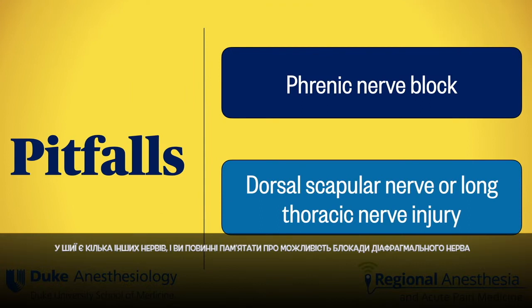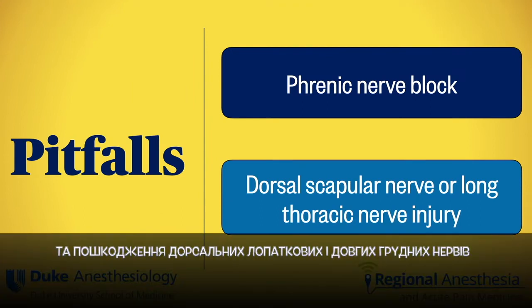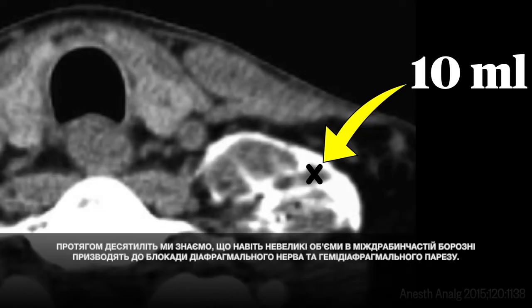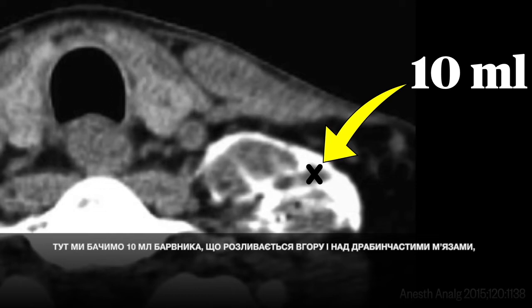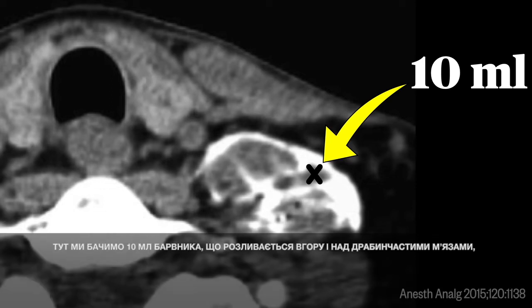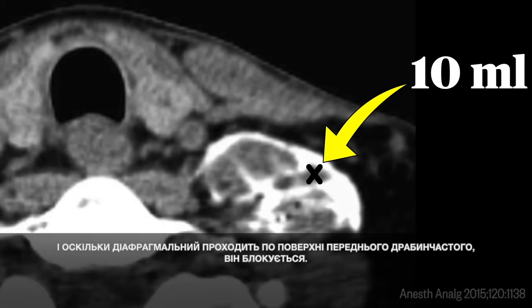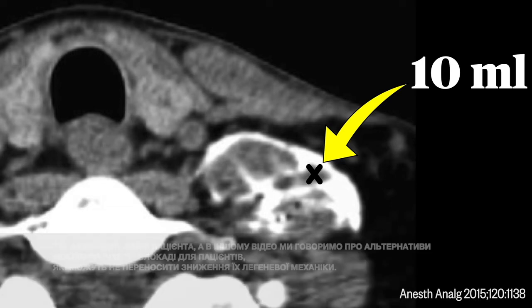There are a few other nerves in the neck, and you have to be aware of the potential for phrenic nerve blockade and injury to the dorsal scapular and long thoracic nerves. We've known for decades that even small volumes in the interscalene groove lead to phrenic nerve blockade and hemidiaphragmatic paresis. Here we see 10 mLs of dye spilling up and over the scalene muscles, and since the phrenic runs on the surface of the anterior scalene, it's going to get blocked. Patient selection is important here, and in another video we talk about alternatives to interscalene block for patients who may not tolerate a reduction in their pulmonary mechanics.